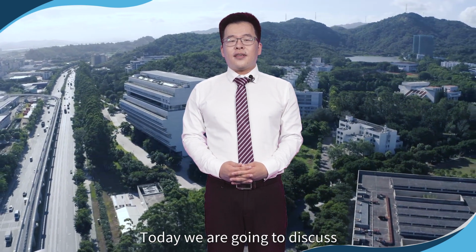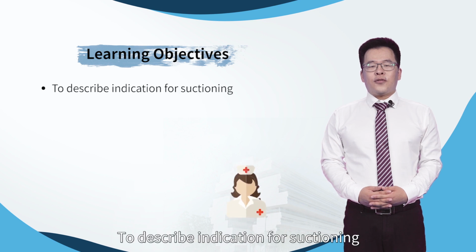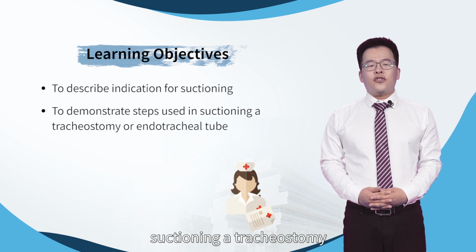Today we are going to discuss suctioning an endotracheal or tracheal tube. Here are the objectives: to describe indications for suctioning and to demonstrate steps used in suctioning a tracheostomy or endotracheal tube.